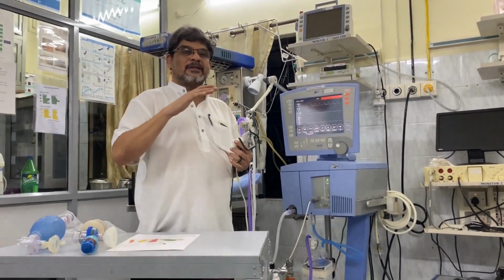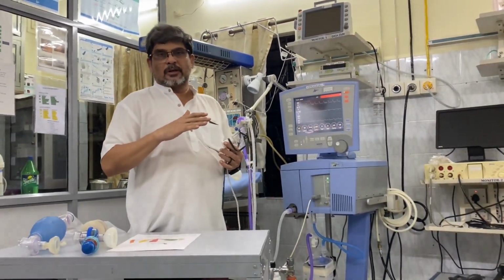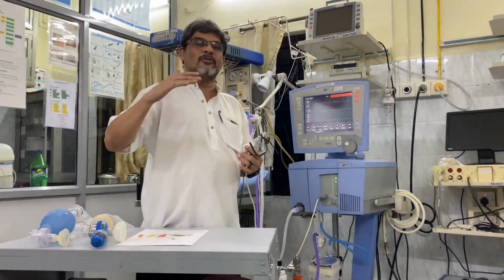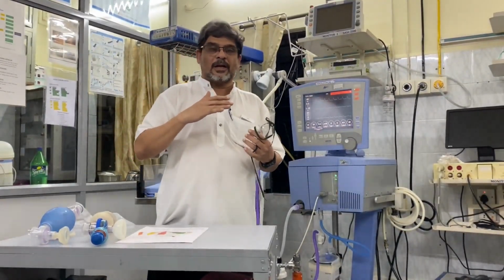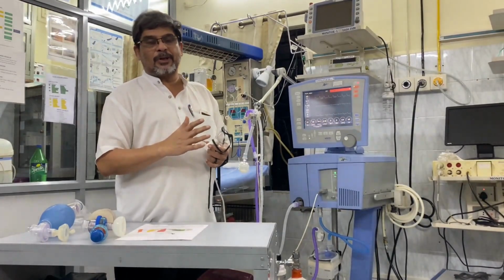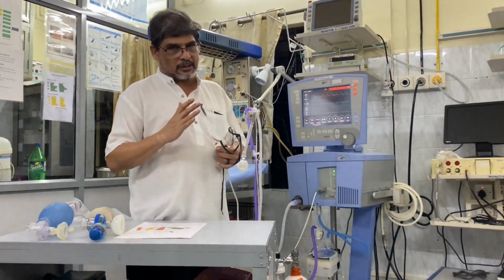Normal PEEP in a normal physiological lung is something between 3 to 4 centimeter of water. In ARDS, we keep on incrementally increasing by 2 till we reach 8 to 10. That is good enough for adults, around 8 to 10 in the case of ARDS, to improve the oxygenation. So by increasing the PEEP, you improve the oxygenation. By increasing the PIP, you improve the oxygenation.